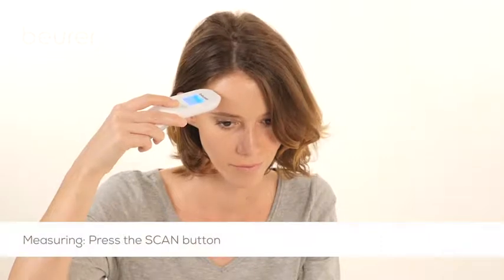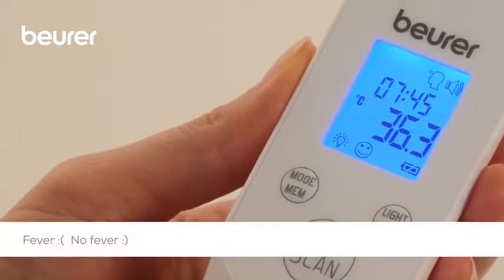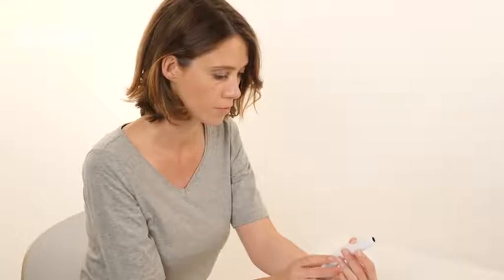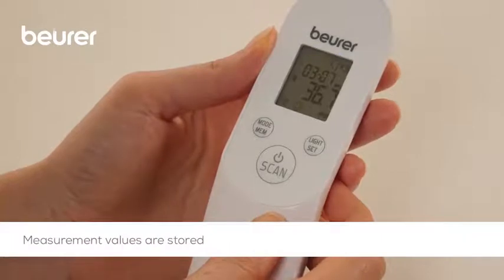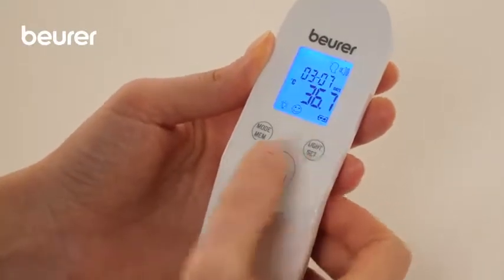Hold the thermometer 2 to 3 cm in front of the forehead measuring point and press the scan button. Depending on whether the temperature is below or above the tolerance for a fever, the device shows either a smiley face or a sad face. The measured value is stored along with the classification as fever or no fever, with the date and time.